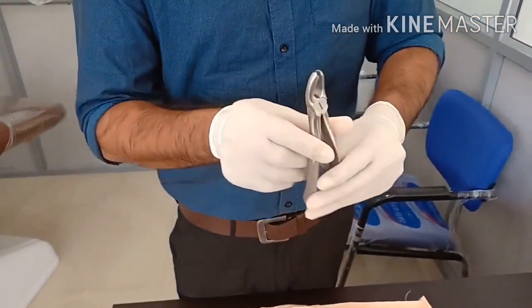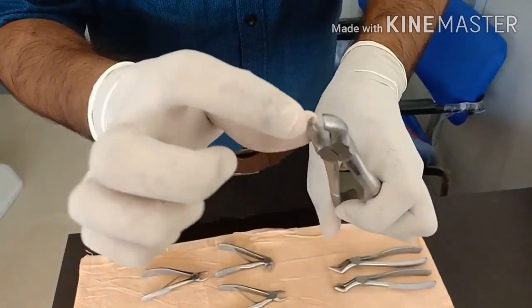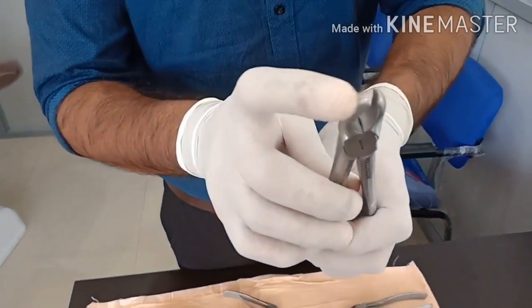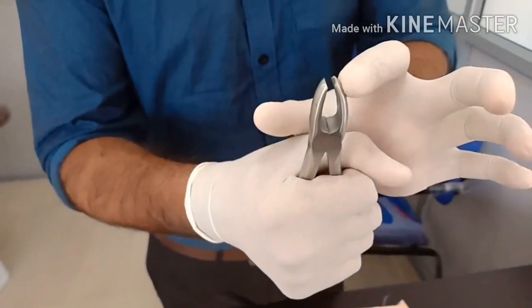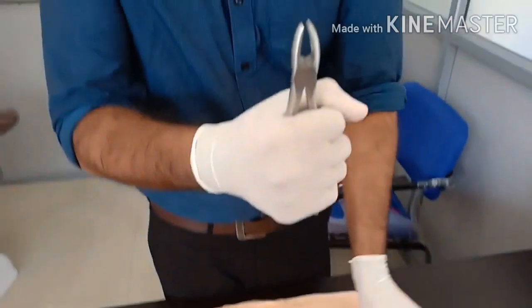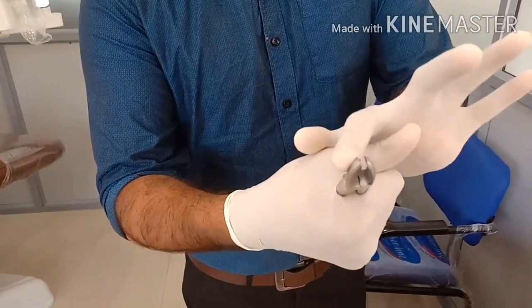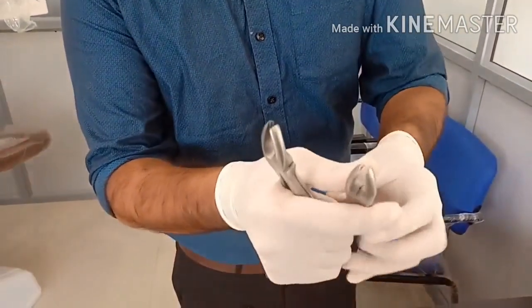This is a molar forceps. You can see there is a beak-like structure on one side and a flat surface on the other. Always keep in mind the beak-to-cheek principle — the beak always goes to the cheek side. If the beak is on the left side, it is for the right molar, and if the beak is on the right side, it is for the left molar. Molar forceps always come in right and left pairs. Always keep the concavity towards the palm when holding.